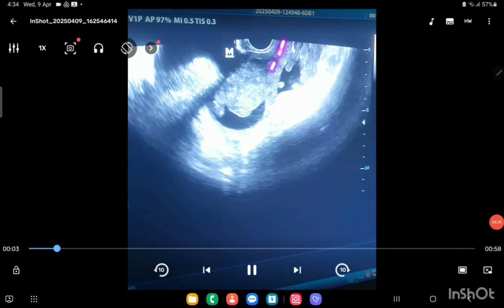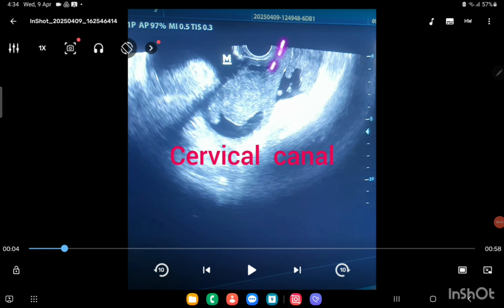Basically these are the things you have to see in the ultrasound. You go through the cervical canal first, identify the uterus, then the cavity. There is no endometrial lining because the growth completely fills the uterine cavity, and there is thinning of the myometrium. The myometrium is very thin because of stretching and distension, with infectious content inside, so the uterine wall, serosa and myometrium are thinned out. There is also a left adnexal mass and ascites. This is a very typical case, a very interesting case.